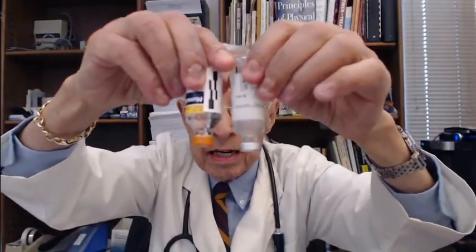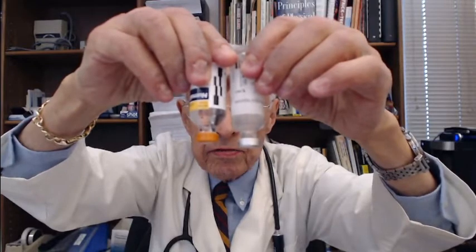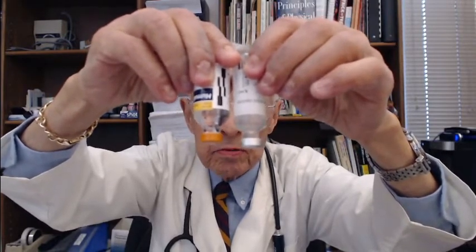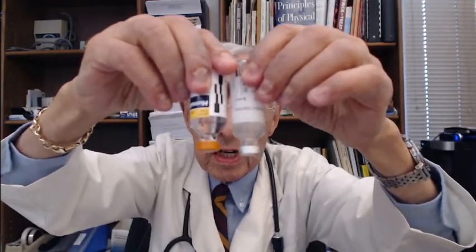Unknown to most authorities in the field, reusing syringes can cause problems with the insulin itself. In my left hand is the reused insulin vial, and in my right hand is a different insulin in a brand new vial. You can see that the insulin is quite cloudy in the vial where the syringes have been reused. We're going to take a look at why this happens and how to avoid it.